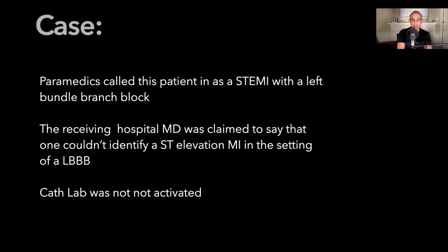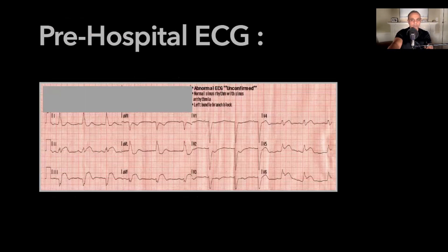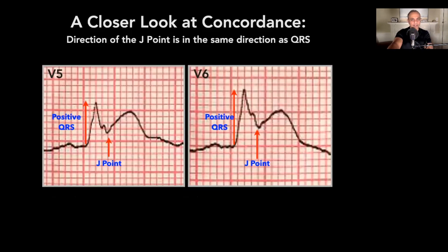Because of that, the cath lab was not activated. Go ahead and take a look at this ECG, and let's look at concordance. What concordance means is that the J point goes in the same direction as the QRS complex.